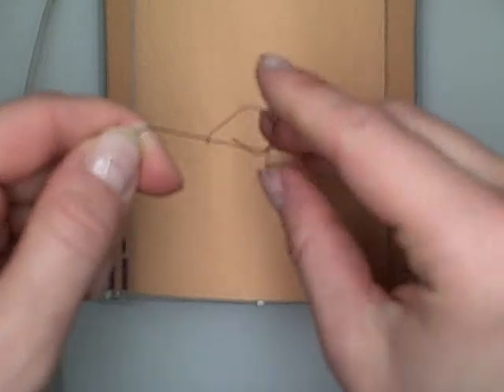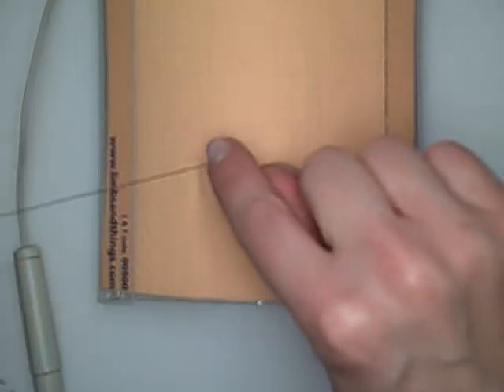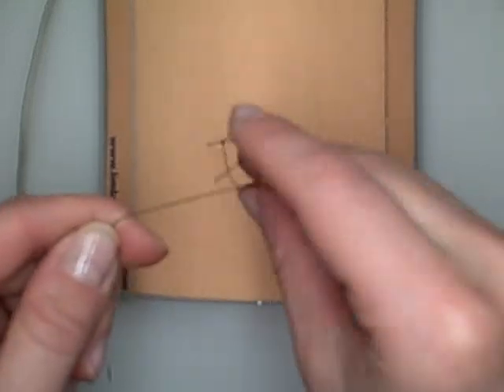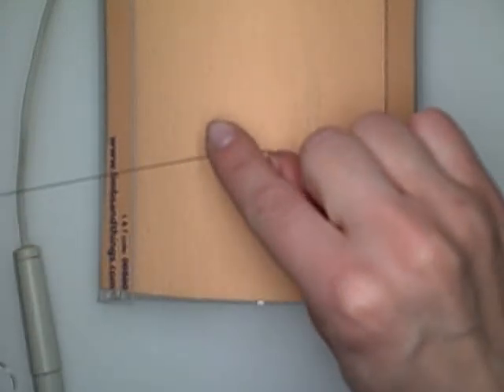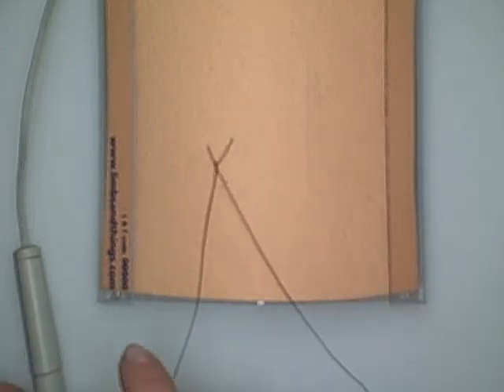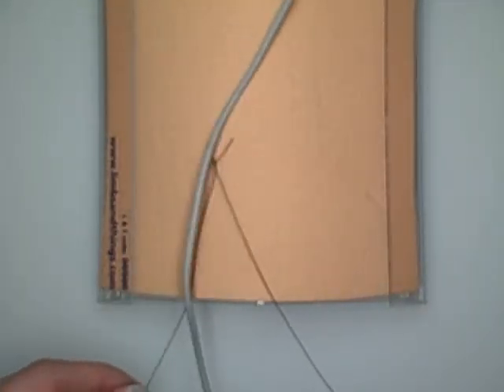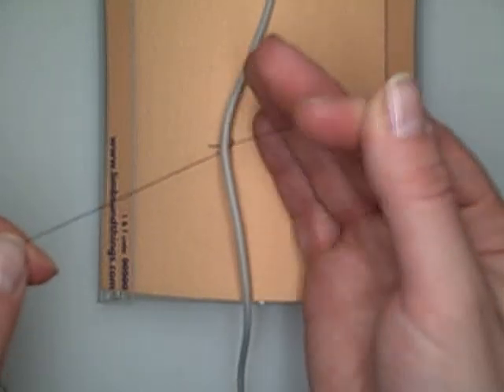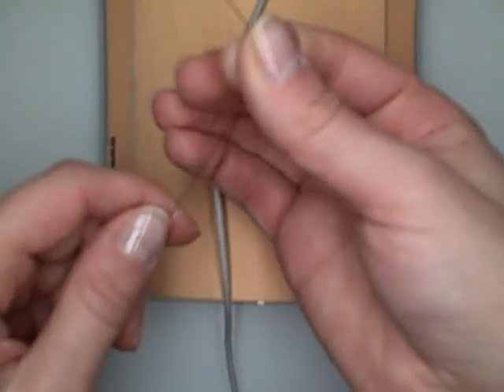You're actually going to use your fingers and tie a one-handed knot or a two-handed knot. You can see that I'm leaving just a little bit of space right there so it's not tight up against the skin. And then we're going to put our drain back in place and tie around here again.